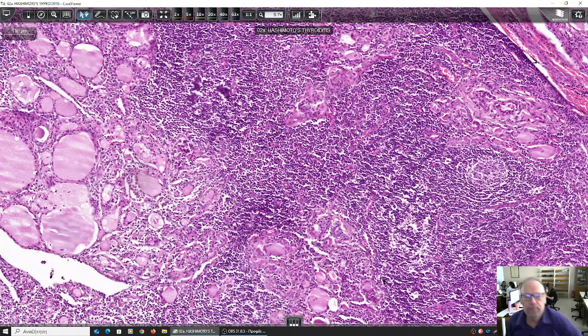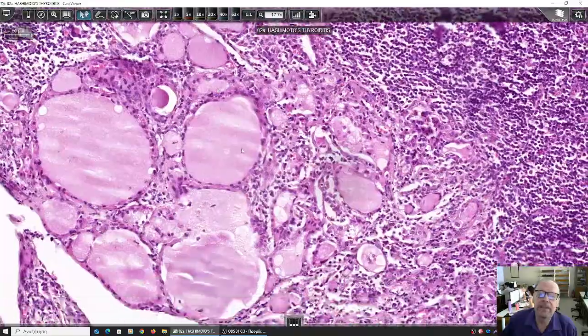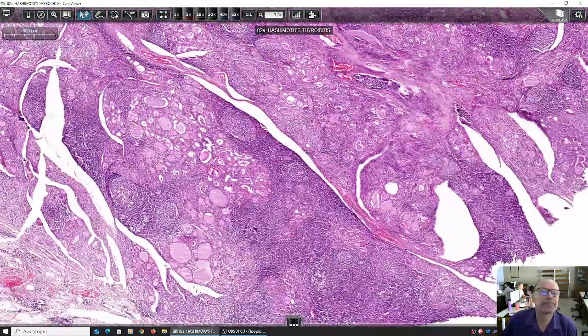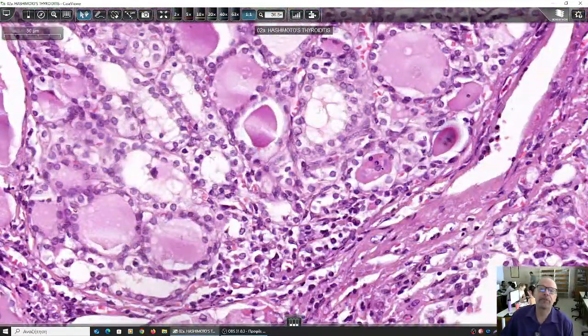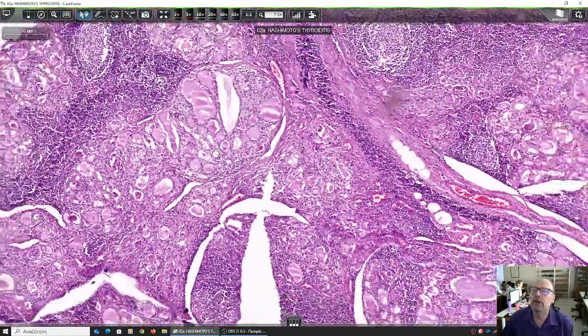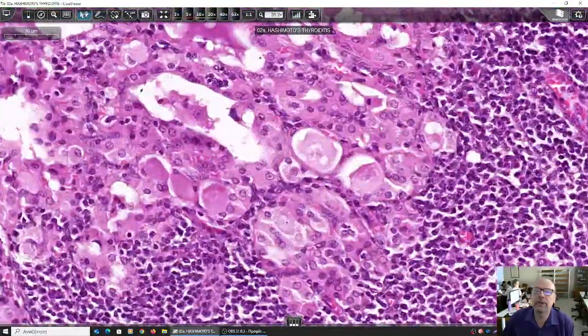No. So, this is the lymphocytic, dense lymphocytic infiltrate replacing the thyroid parenchyma. All right. Next, have a look at the cells lining these follicles. Let's check. These ones. Yes, I like them. You see? These are the cells lining the follicles. Have a close look at these normal appearing follicular cells, in contrast to these ones.